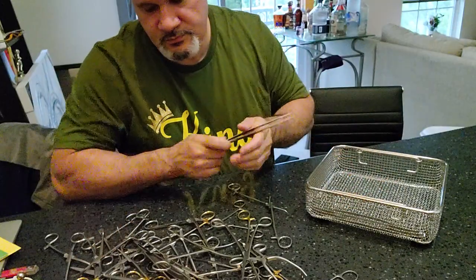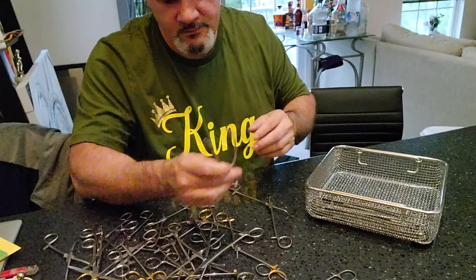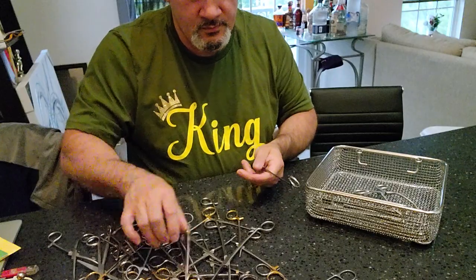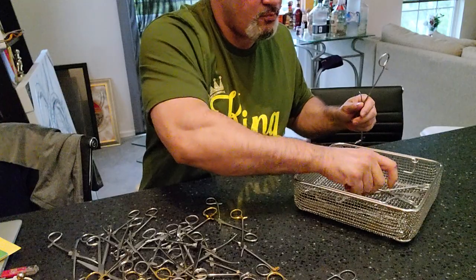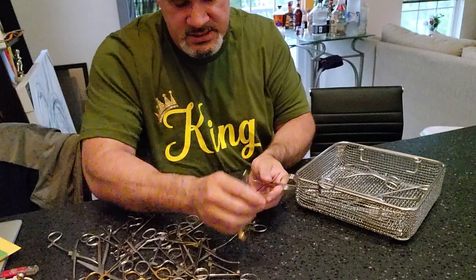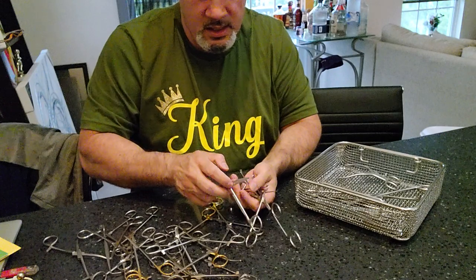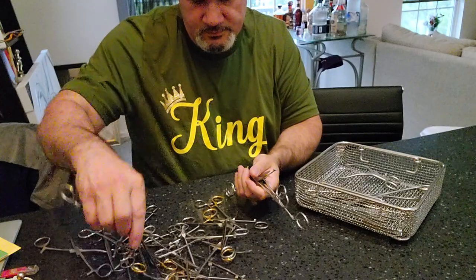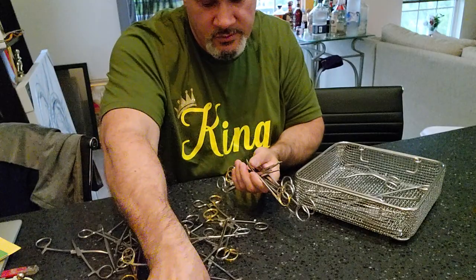As a scrub tech, when you've finished scrubbing, how should your instruments be sent to decon? They should be pre-cleaned, they should be in the open position. I'm going to show you how instruments should be coming to decon. This is going to be a long video, so stay tuned.